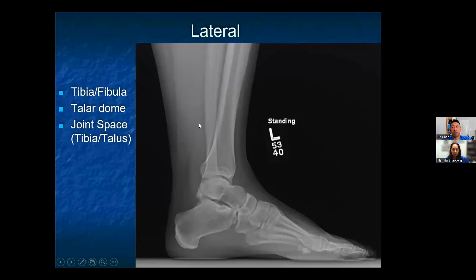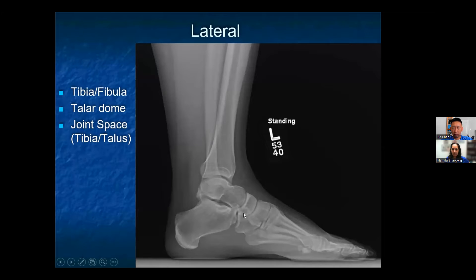When you're looking at the lateral view, the following bones can be assessed: the tibia, the fibula, the talus, the cuboid, the navicular, the calcaneus, and the fifth metatarsal. The distal fibula should be superimposed by the posterior part of the distal tibia. The talar dome should be superimposed as well, and then the joint space between the tibia and the talus should be uniform.